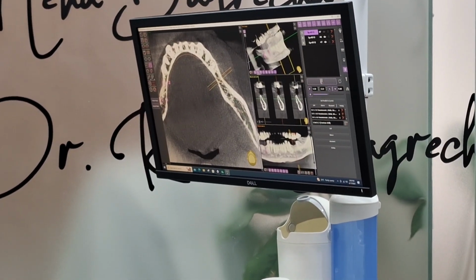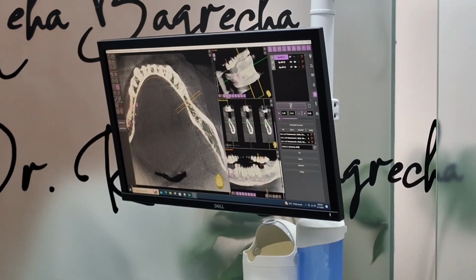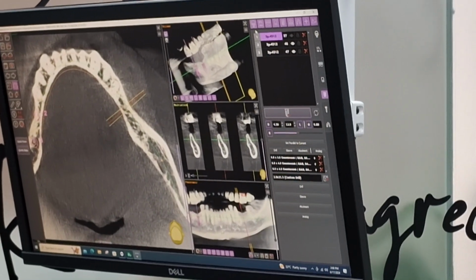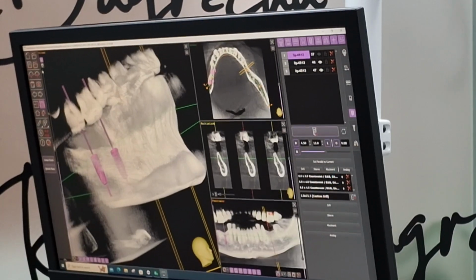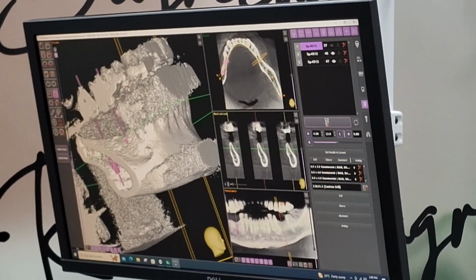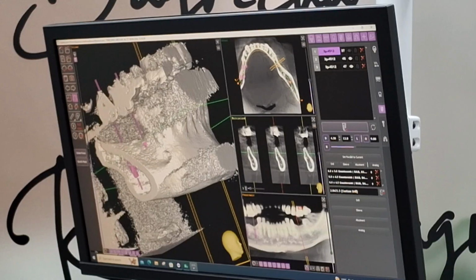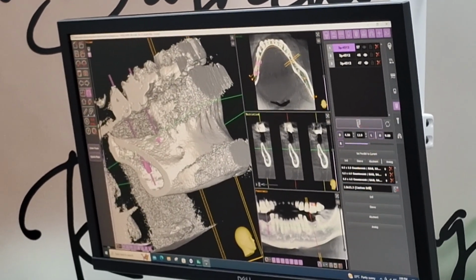But because there are two implants now, I don't want a broader implant. Two implants can take care of the prosthesis because we're going to fuse them. So here we have not done a ridge split. We have opened the area and placed the implant. These exposed threads which we have just seen were exactly the same way in the patient's mouth when we placed the implant. This area we have grafted with bone, and on the other side we did the ridge split.